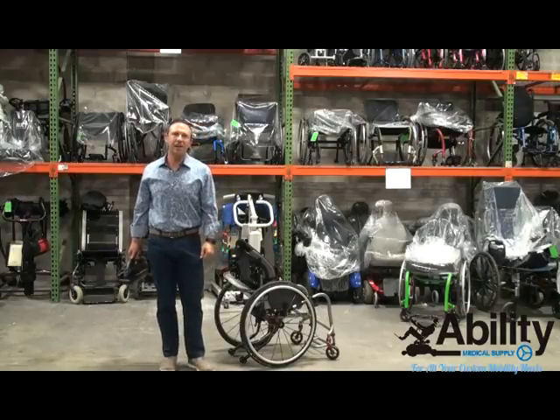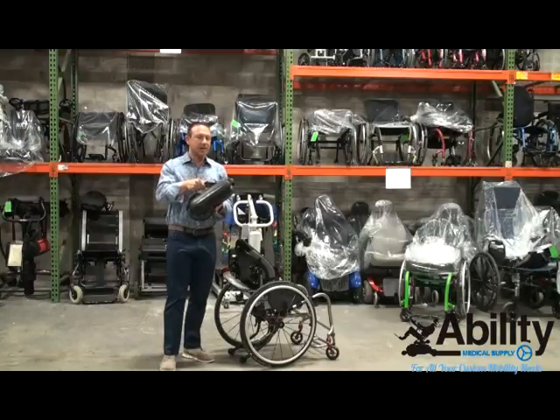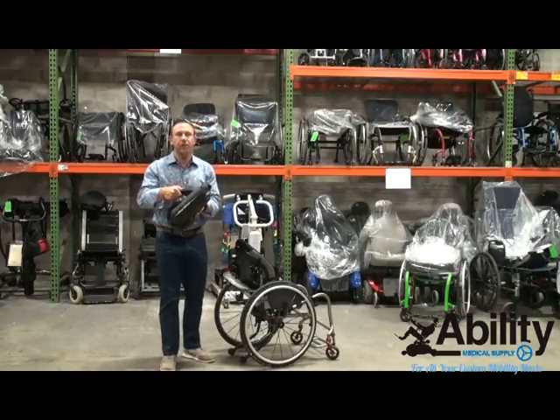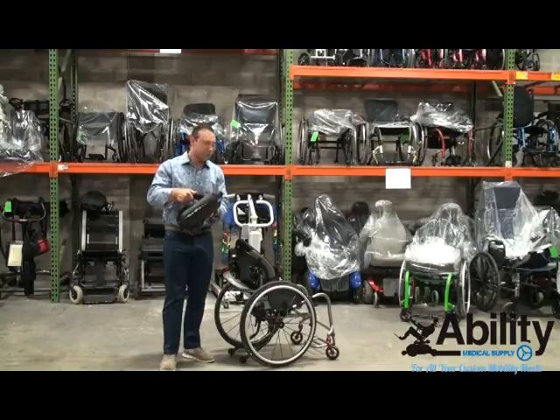Today we're excited to talk to you about the SmartDrive by Maximum Mobility. This is a great new unit that just came out, and it's really easy to use. It's really good for people who don't have enough upper extremity strength to continually push a chair all day long, over thresholds, up and down ramps, and to cover long distances. And it's really cool.